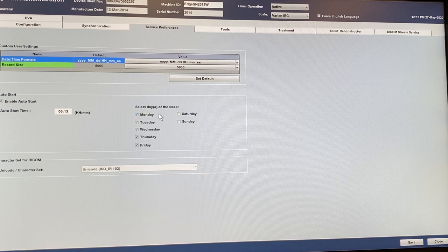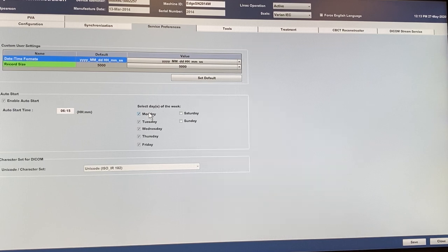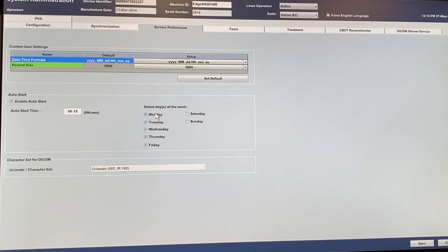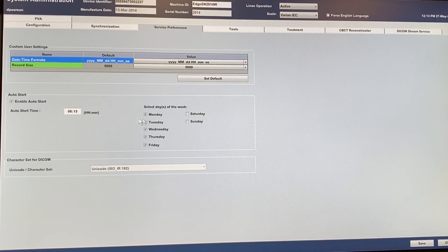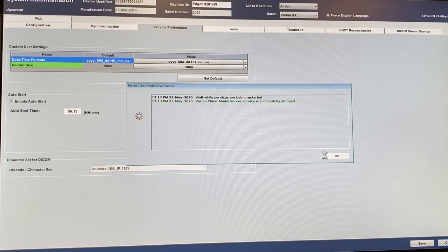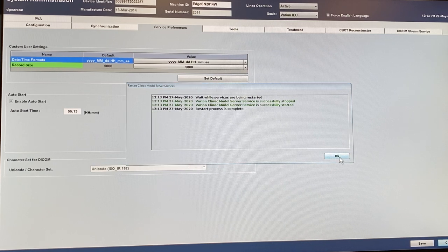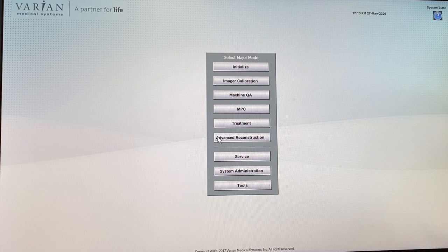It looks like it's already been fixed — on Monday the machine will be scheduled to start, which is good. When it's a holiday weekend this would be unchecked, but someone's already done it, so I don't need to change anything in here. I'll close out and go to service mode, which will take a few minutes to load.